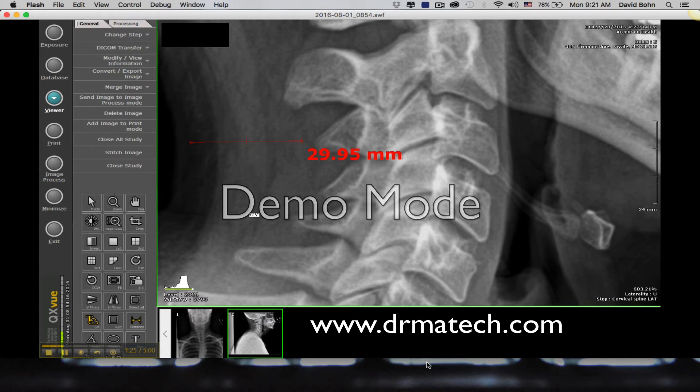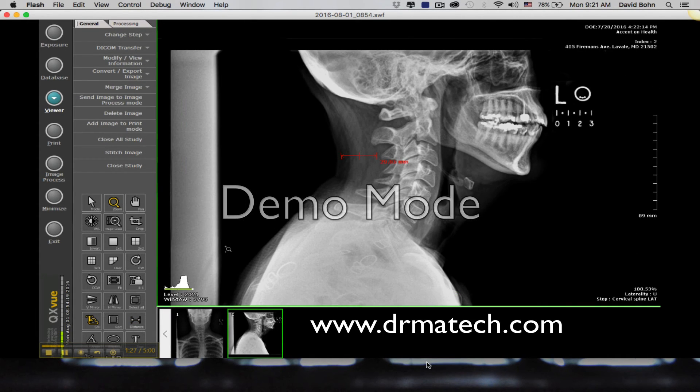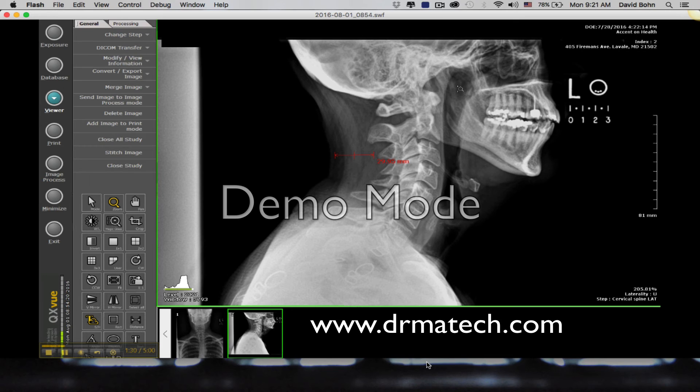And so when you've done that, you can zoom back out and then crop the image that you need, and then you're all set.